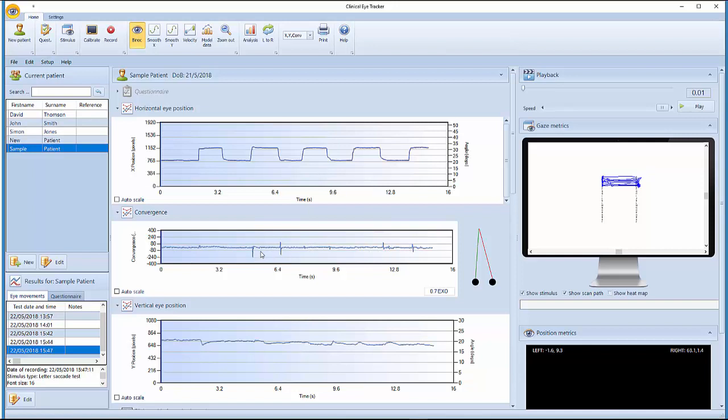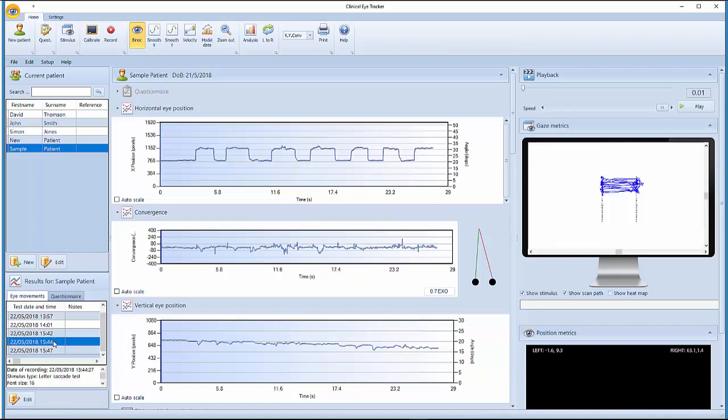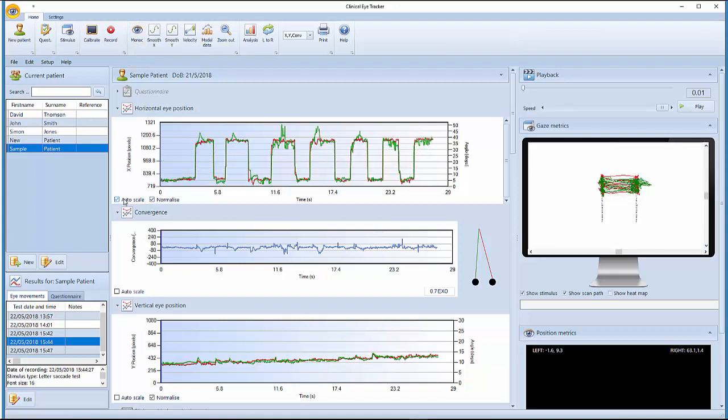You quite often get these little spikes where the two eyes get slightly out of sync during the large saccade, but very rapidly binocular vision stabilizes. Now if I show you the same results for the patient with what we think is a dynamic binocular vision problem, again when you look at it binocularly, it doesn't look too abnormal. He's not fixating quite so accurately as the other patient, but the really interesting thing occurs when we start looking at what happens with each eye.